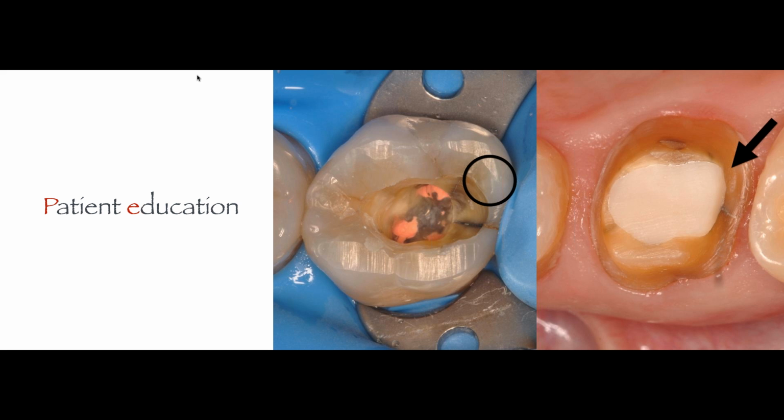So we are documenting what's going on. We are documenting that the patient came to our practice and he had a fracture before we did anything to him. This is the way that he presented to the clinic. So, in a way, we document every procedure. And if you ever have any issues, you have this powerful tool. You have the photo that was saved under the patient's chart to prove what you did to that patient and why you decided to do it this way.